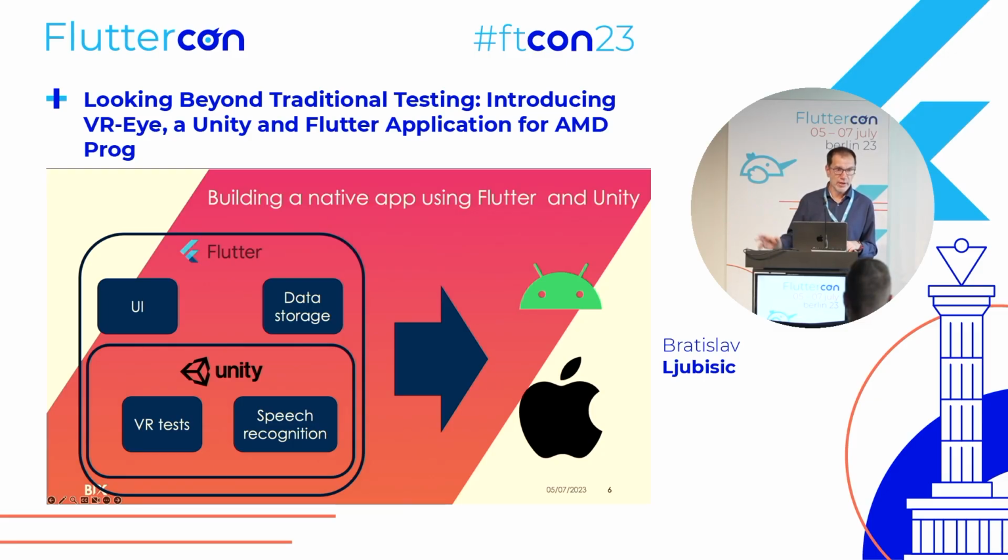That's the VOSK library, which is also available for iOS, but not for Android and not for Flutter. So we could only use it through Unity. This is a very small speech recognition library that has its own limitations, but more on that later.